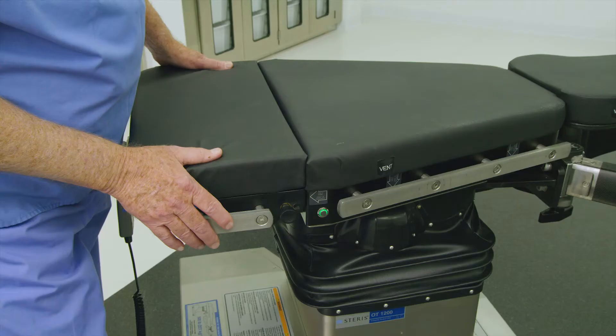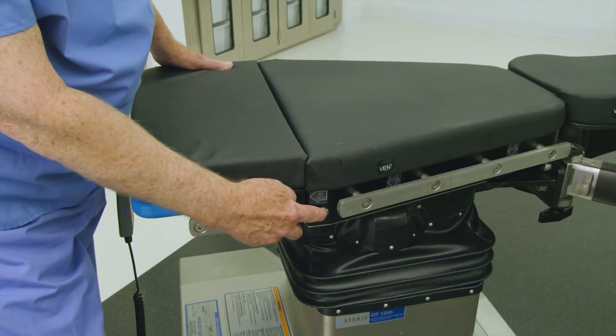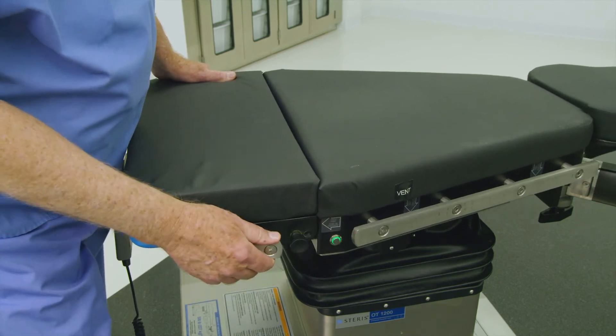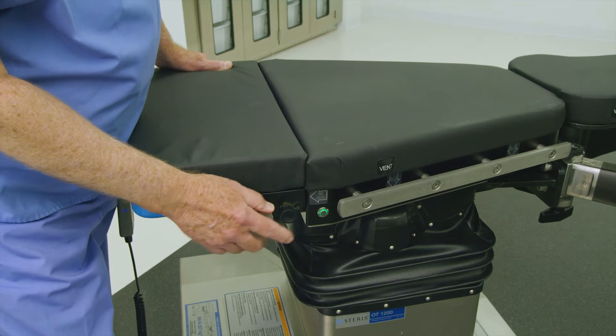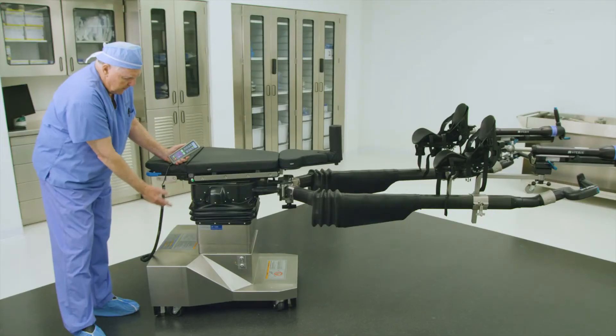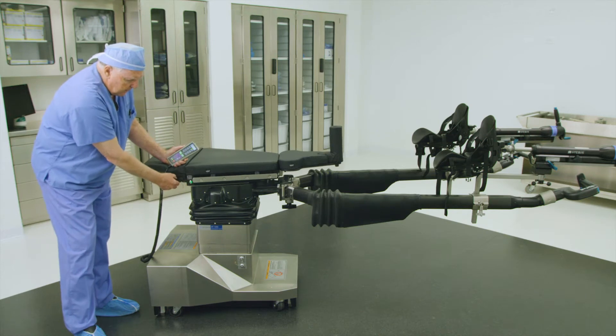The preferred method to translate the tabletop is through the illuminated buttons on the side of the tabletop. Press and hold the manual green unlatch button located on either side of the tabletop, and then physically push the tabletop laterally left or right until it locks in position.